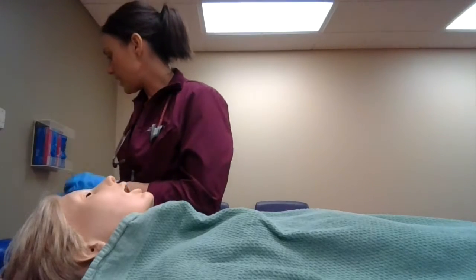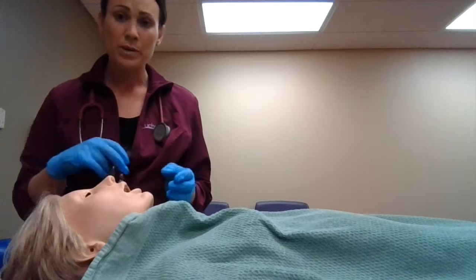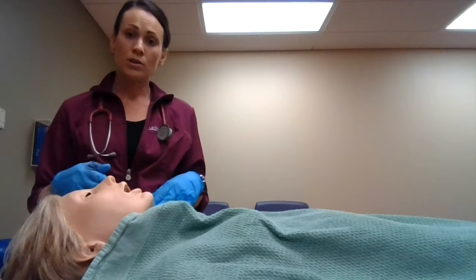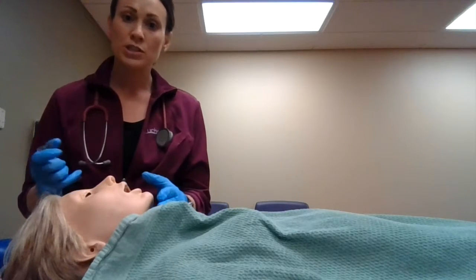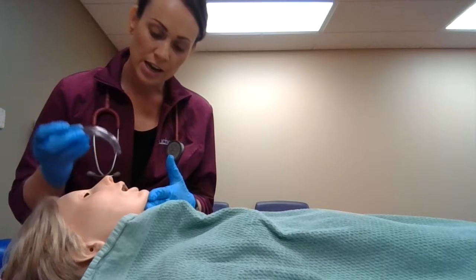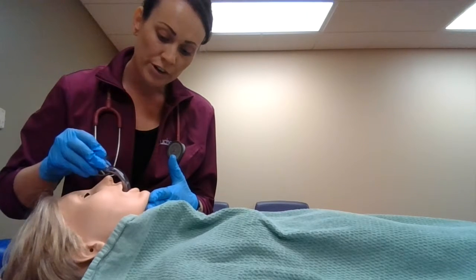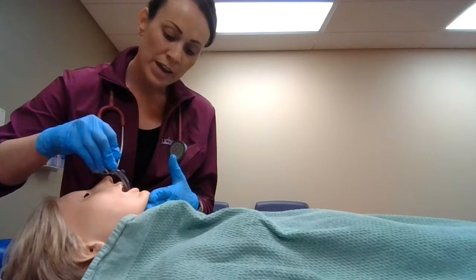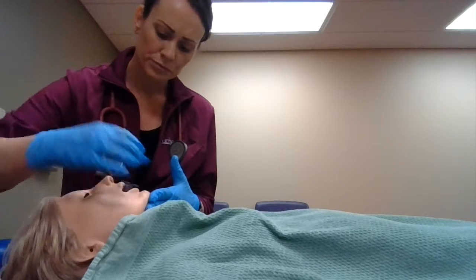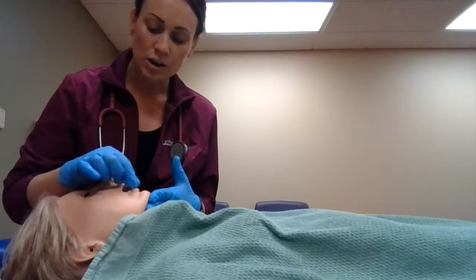We'll go ahead and use a 10 centimeter oral pharyngeal airway. Because she is a full trauma, she does have possible spinal cord injuries. So I'm just going to do a 2-finger chin tilt, try to displace that tongue out of the way, and I'll insert this Goodell oral pharyngeal airway halfway, and then a 180-degree twist. The flange is going to sit right on her mouth and on her lips.